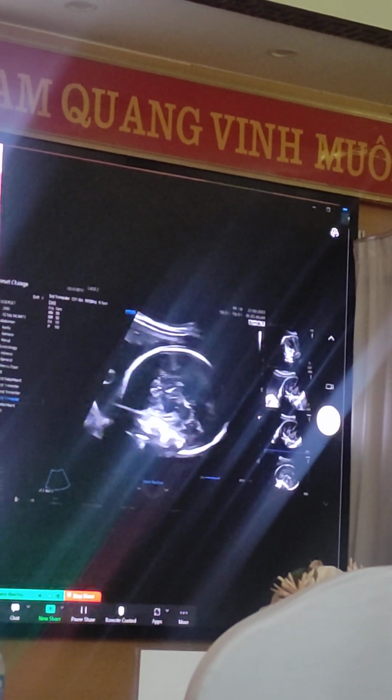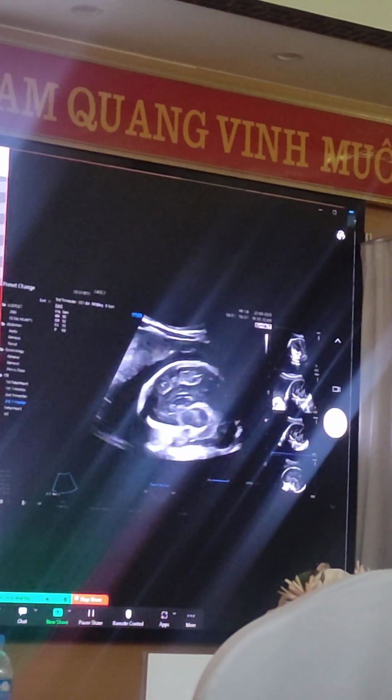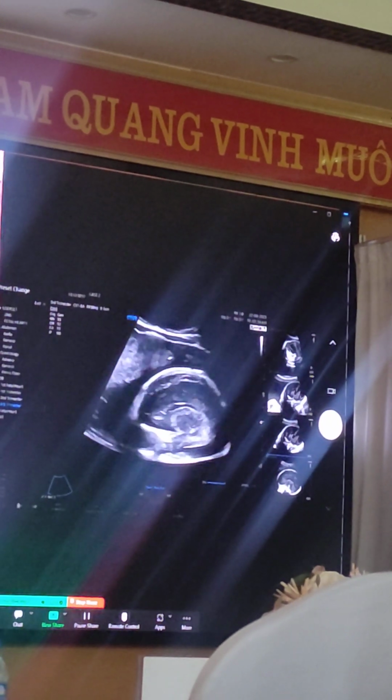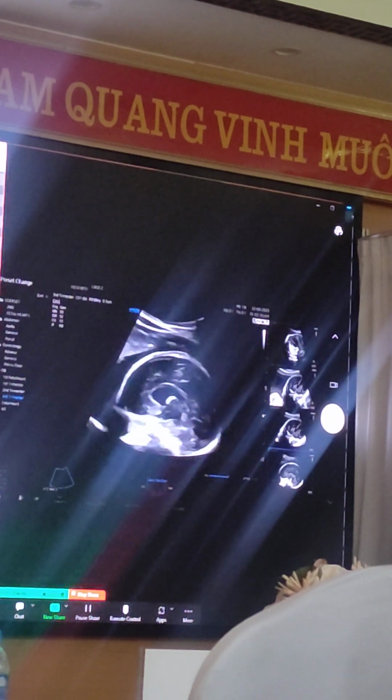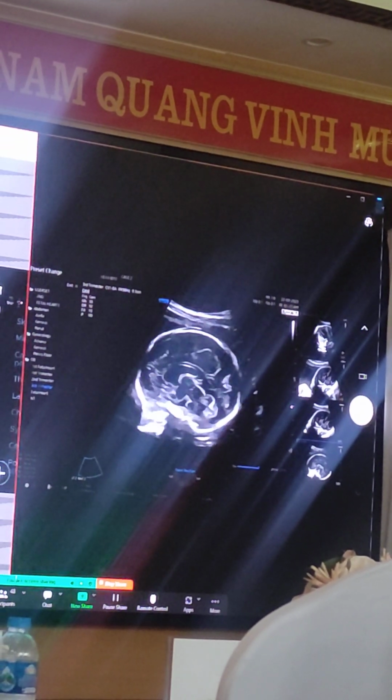And you can see that this cavum is actually effectively big, but nothing abnormal with it, so you call it the cavum vergae, and that's it. Then you've got the brainstem. Can you freeze?